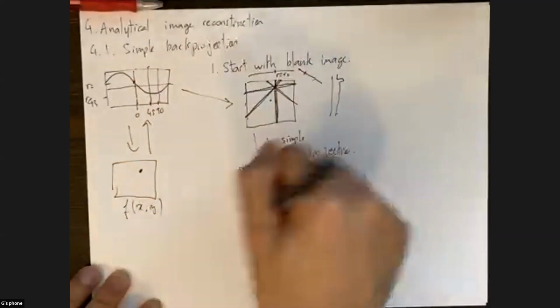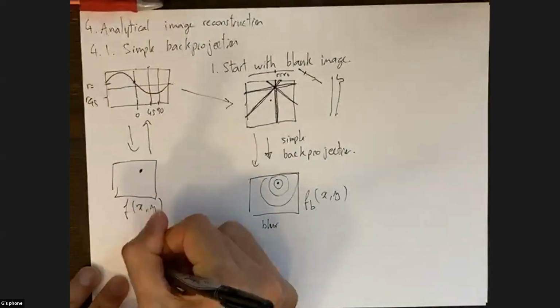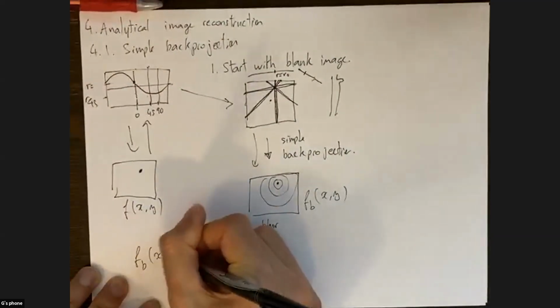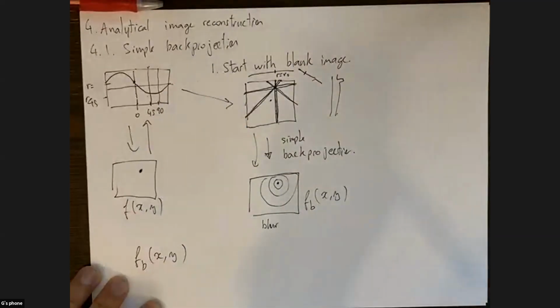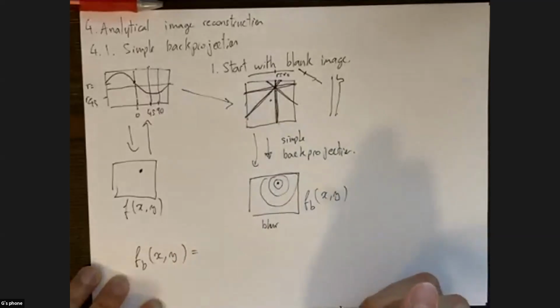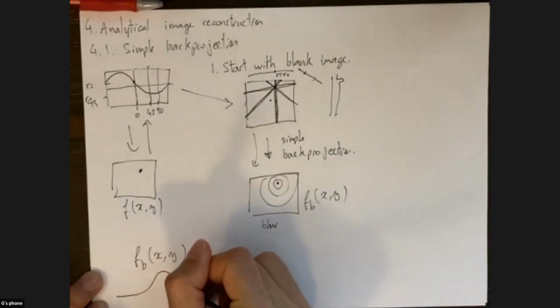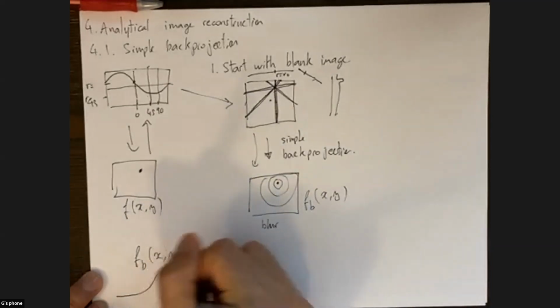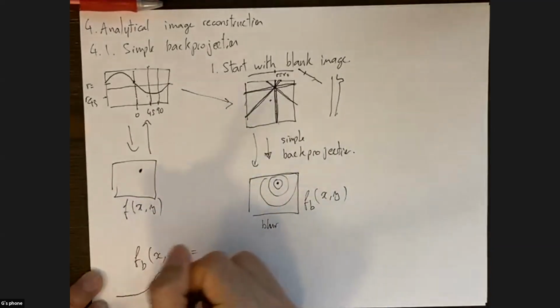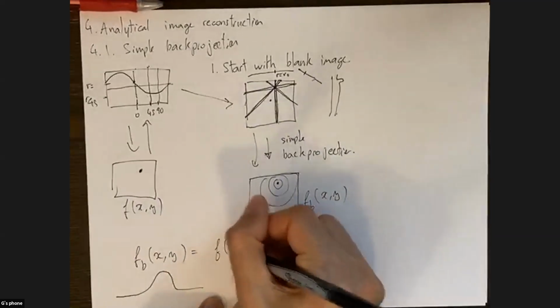So the whole pipeline is summarized by this convolution. And I guess this is something you kind of have to accept. I can't really demonstrate why, because it's a whole class in itself. But this is the blurred back projection image, which, if I was just looking at it in 1D, is what it would look like. And it's equal to the original image that was not blurred.